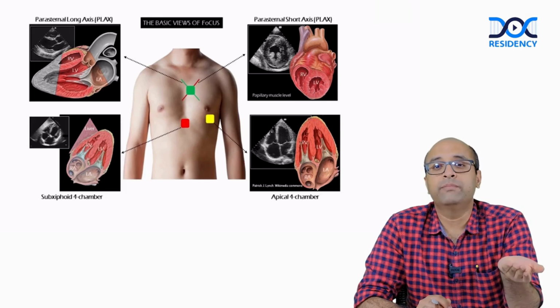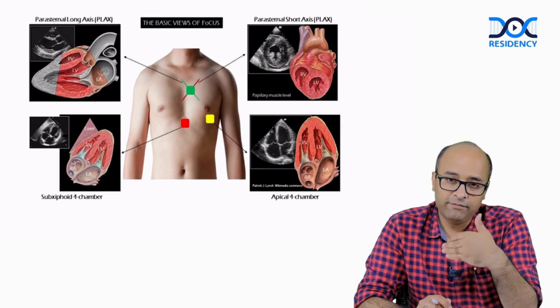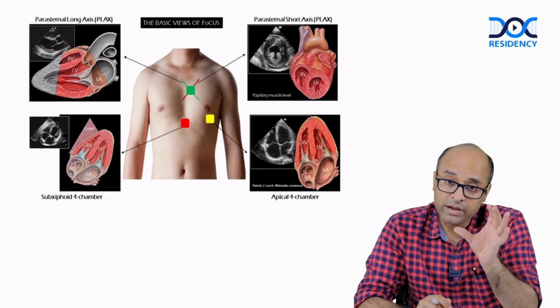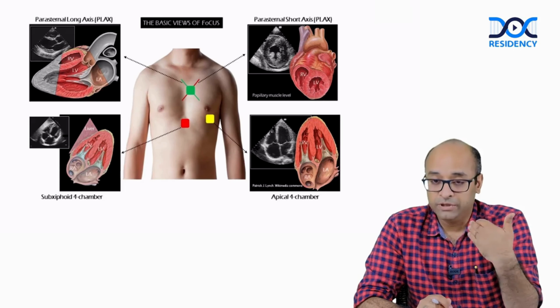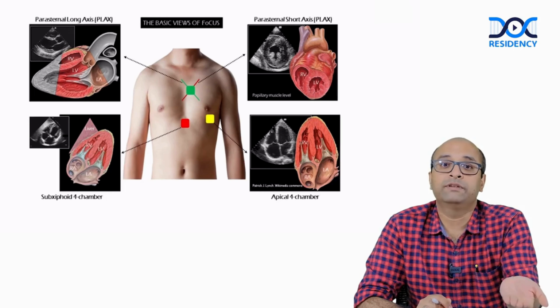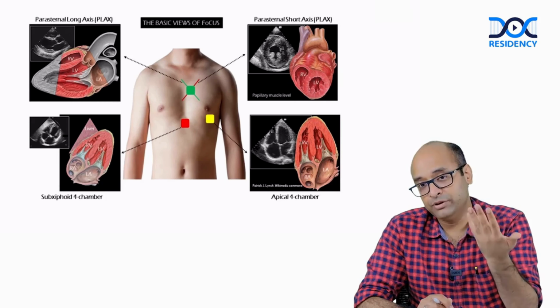That will give you a better understanding of what all you have to do, so that you can make a decision wisely by looking at the entire organ and the muscle involved in that view. Do not just put the probe and decide after looking at the first image. Always probe it better and use that information to decide.